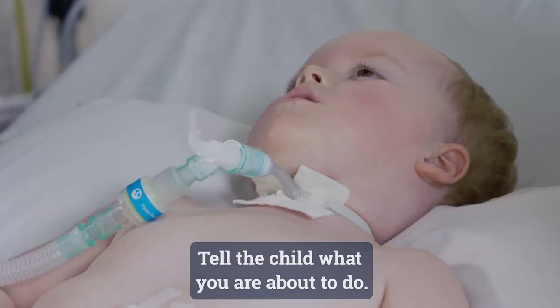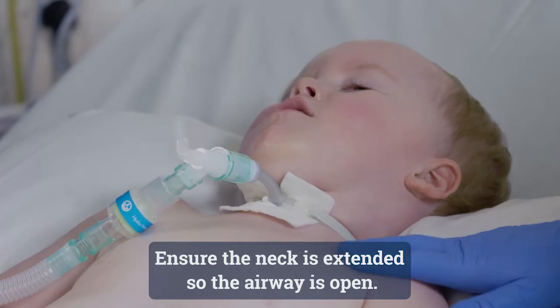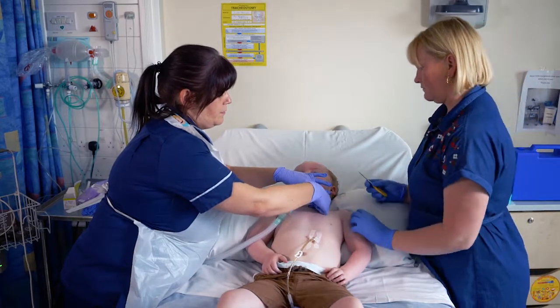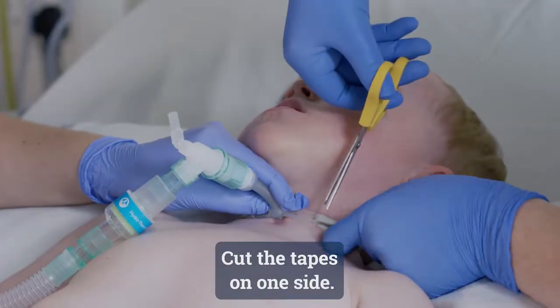Right, we're just going to change the tape. It's going to be very quick, but really it's here to help as well. It's okay. Cut the tapes.